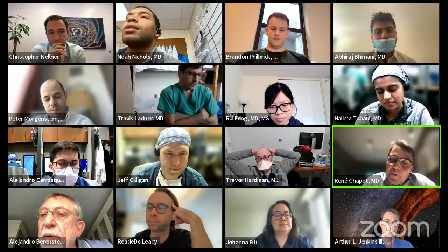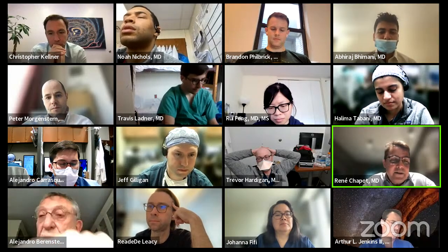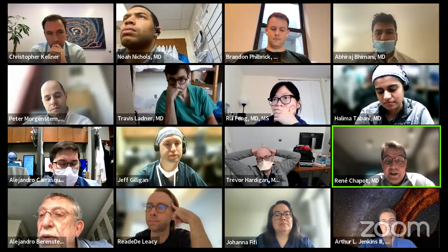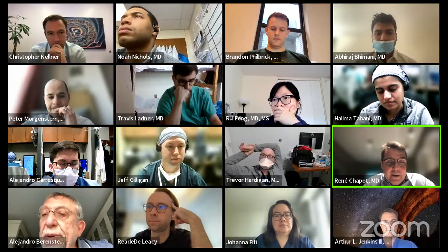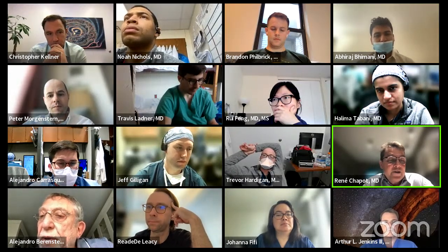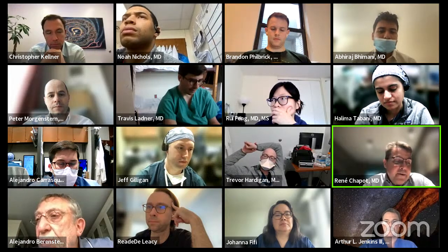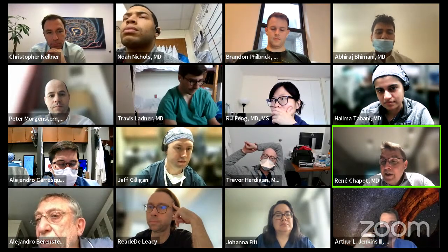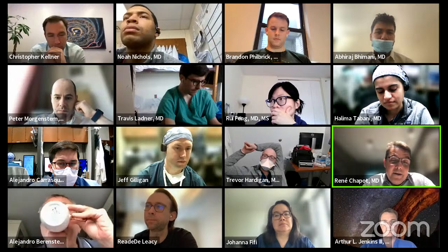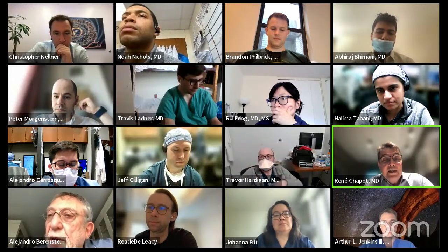I did not mention a point which I believe is super important, which is to have an embolic agent with less viscosity. The viscosity of Onyx is based on one simple fact, which is the ability to plug. You inject, it goes in all directions, and at some point it plugs so that you can inject it in the desired direction. By making it more diluted, you cannot plug, which is the reason why the engineers at MTI who developed this product said we don't want to make it more diluted. But in fact, if you create the plug another way, then you can use this more diluted embolic agent, whose likelihood to fill all the shunts is much higher.